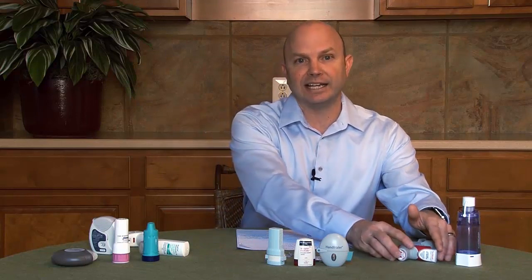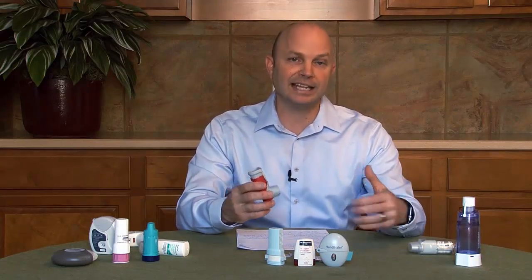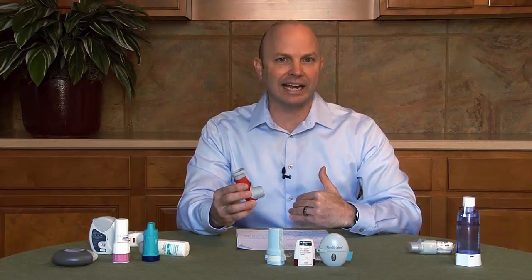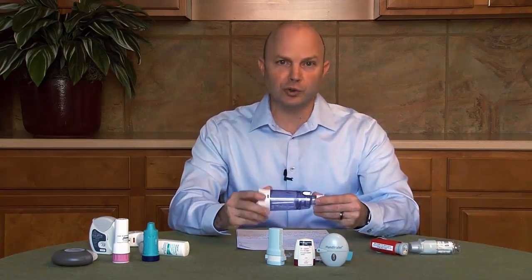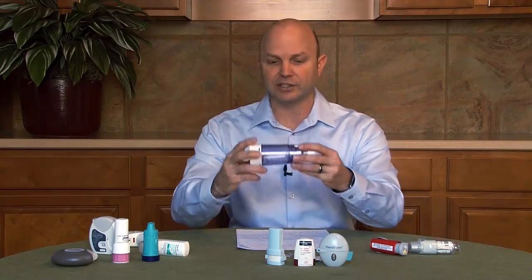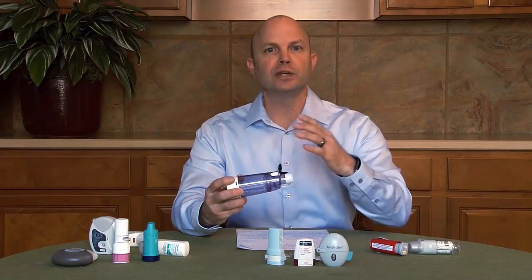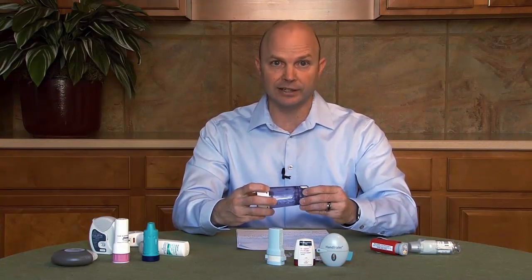The HFA inhalers are actually a slower, softer mist. And studies have shown that with the slow, soft mist, you get more medicine deposited inside your lungs. And valve holding chambers are also used with these pressurized MDIs. The medicine is suspended inside the chamber, and when you take a slow, deep breath into your lungs, you'll get more medicine deposited directly where you need it deposited.